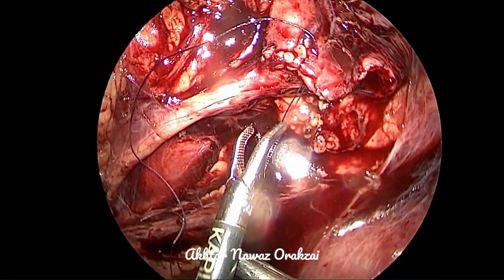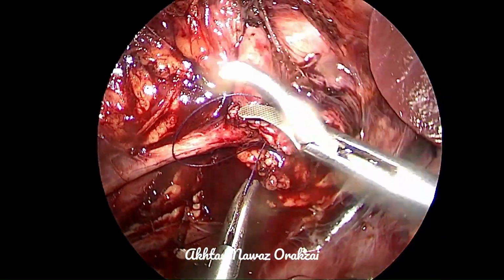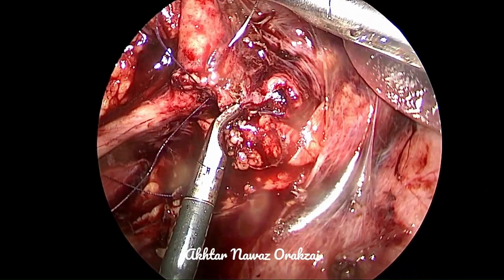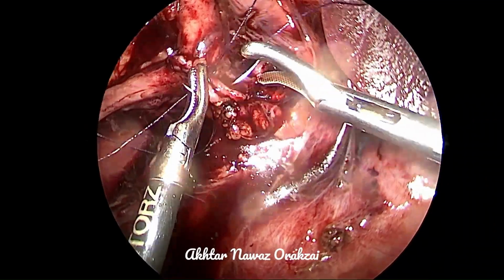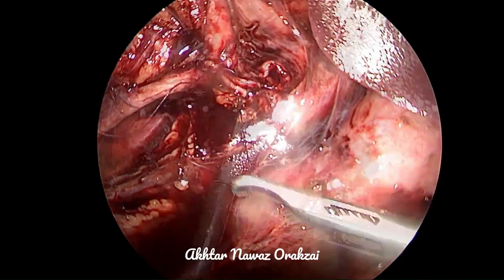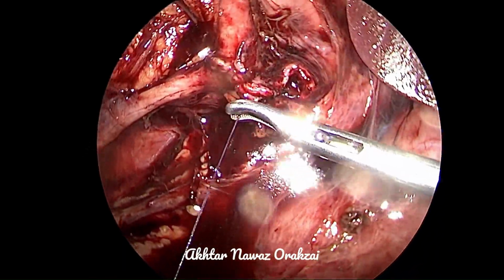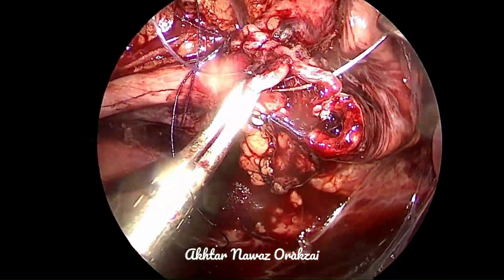However, literature also says that 20 to 30% of the cases do have an external factor like a compressing vessel, and an intrinsic factor as well in the form of adynamic segment. And the cause for failure of pyeloplasty in such cases is usually not excising the pathologic segment. So the pathologic segment must always be excised as a general principle of dismembered pyeloplasty.